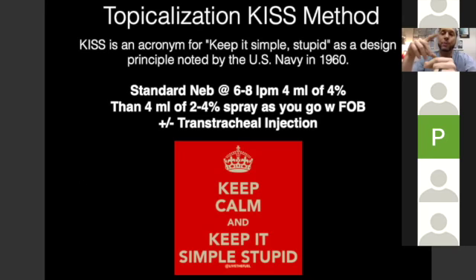You go through and you aspirate. When you see bubbles, you slide the catheter in. You take the syringe and the needle out. And now you have an intratracheal catheter and you spray your local. Now, how do you spray your local?